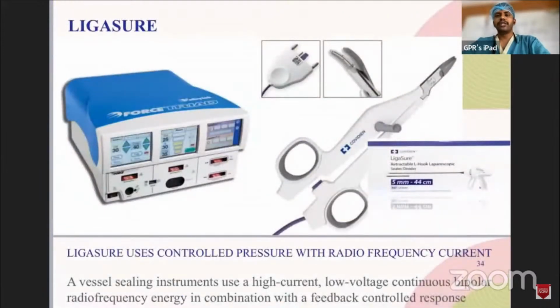The first and the best of everything to use is the LigaSure, which is nothing but an advanced bipolar, in simple terms. It is available in different sizes and formats, and it has its own disadvantages too. It has two different jaws, and both of them are active.